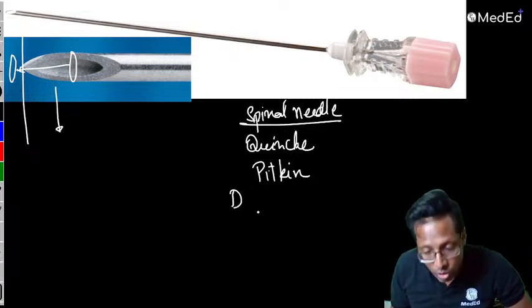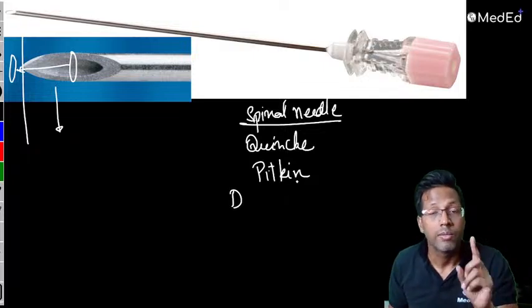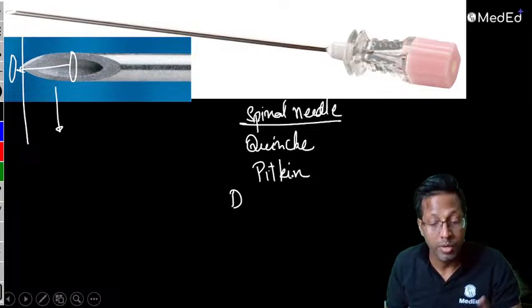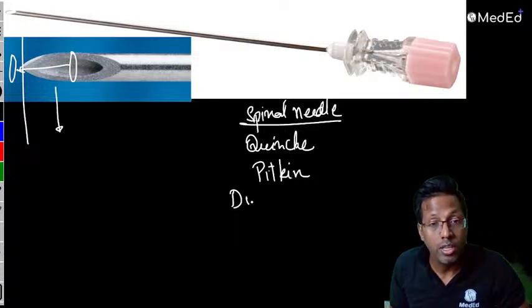No, it is not Veress. Dr. Veer, this is a question that has been asked in exams, it is not Veress. This is a spinal needle. That's why I'm discussing this. Correct, Dr. Veer. Spinal needle. This is what is called dura cutting. It cuts the dura.